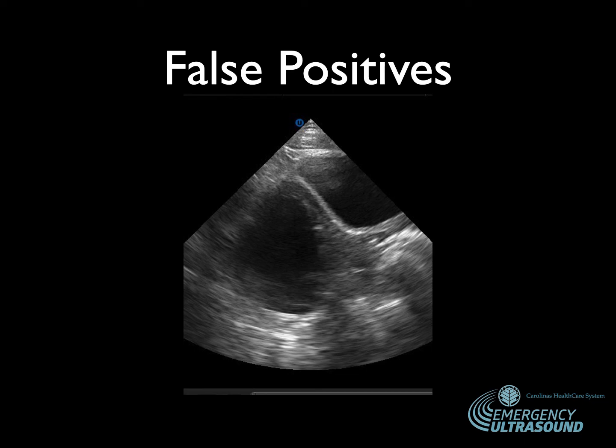Now what about that one? That looks like a whole lot of fluid right behind the bladder, but it's actually a large ovarian cyst. So note the smooth walls of the cysts that are not outlining the bladder or bowel. So free fluid in the pelvis will have sharp edges as it starts to outline bowel. This one is nice, round, smooth, and so that is an ovarian cyst.